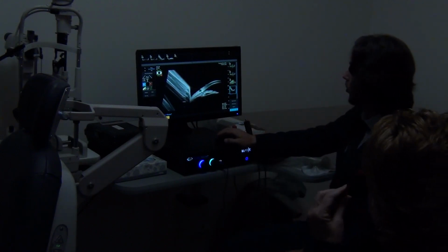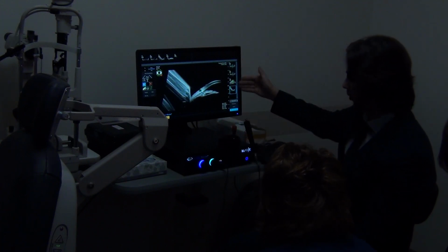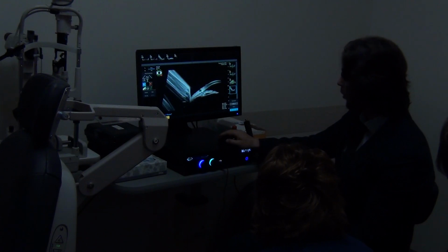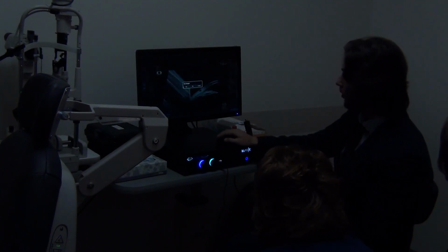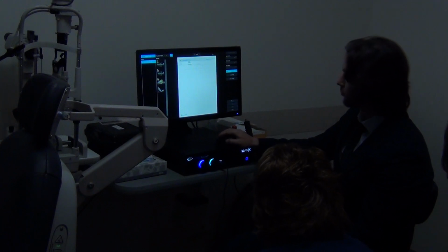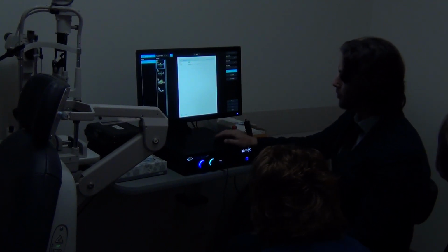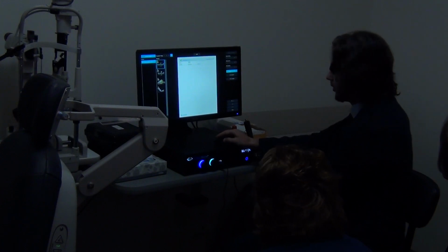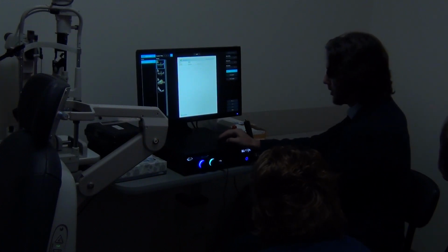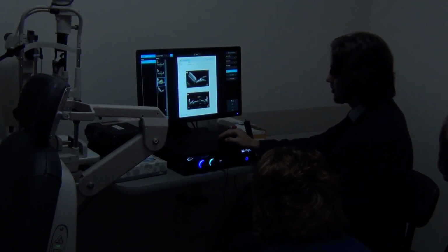So we did numerous images here, right? So we did save frame, all frames are saved. Then we go to report. Yes, you want to save changes. Just make sure you always save the changes. So the report is coming up, with the patient ID, name, date. Then you simply choose images. You can use the control button, I'm sorry, the add series. And you just add those into the report.